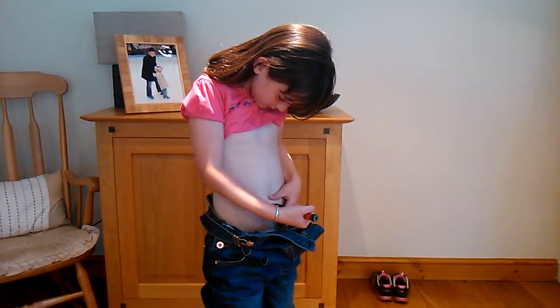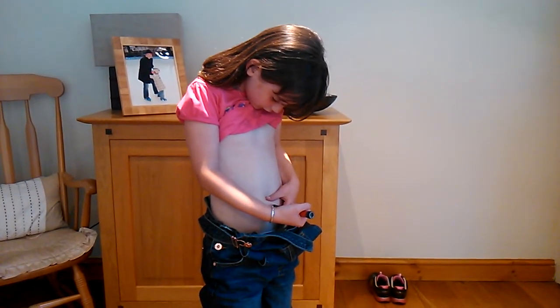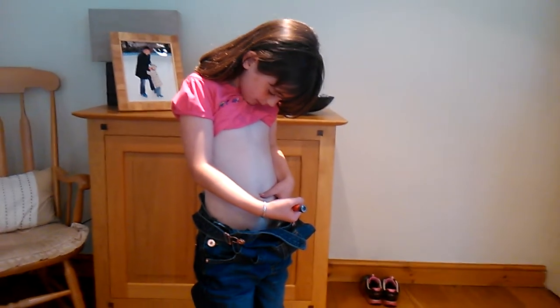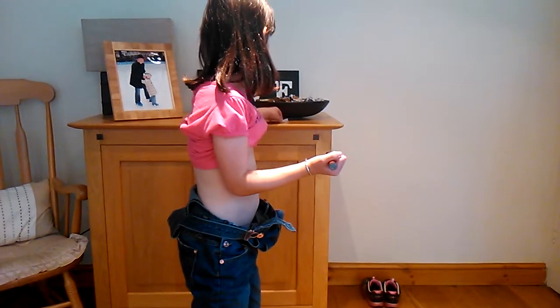One, two, three, four, five, six, seven, eight, nine, ten. And then I put the lid back on.